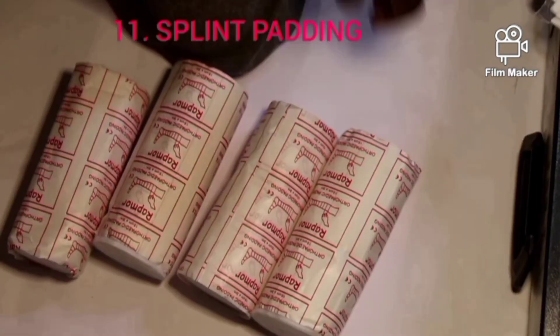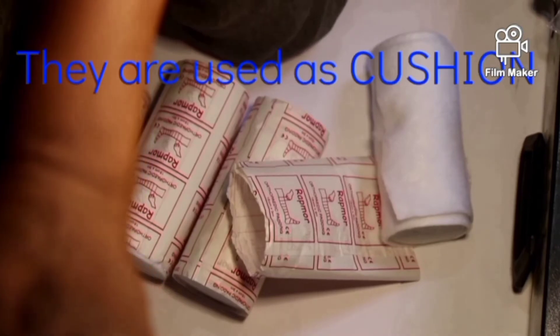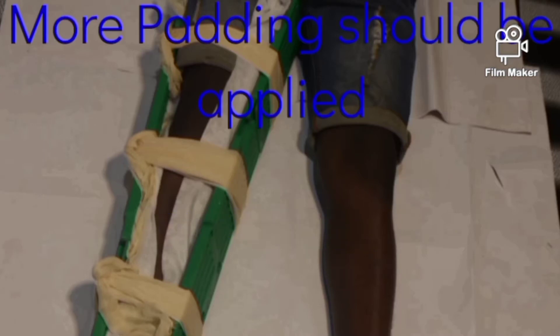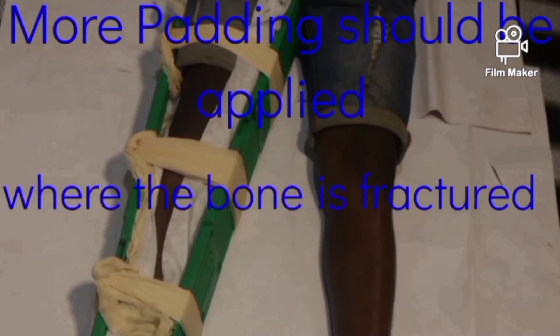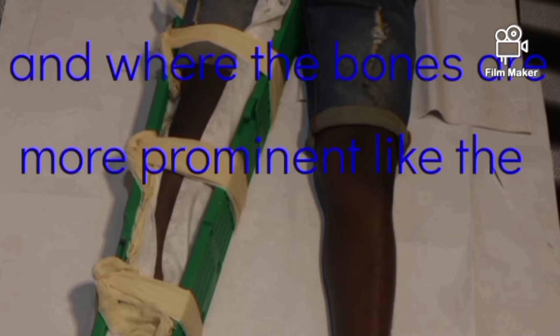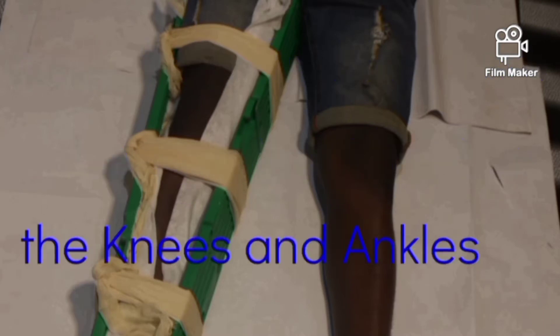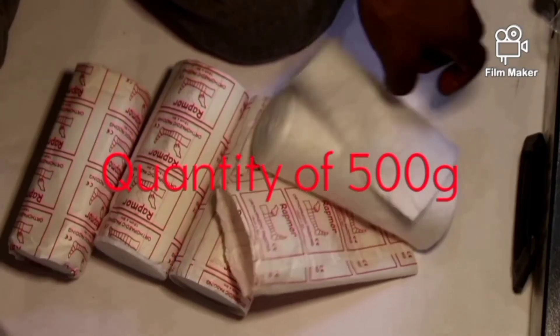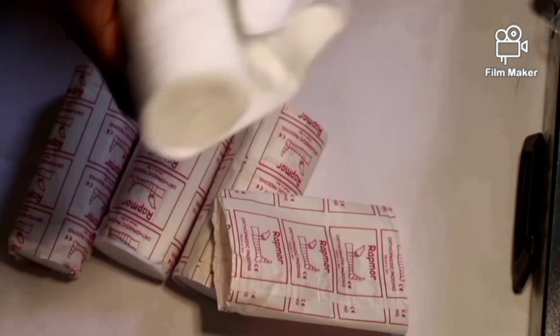These are splint paddings. They are used as cushioning when splints are applied in case of fracture. More padding should be applied where the bone is fractured and where the bones are more prominent, like the knees and ankles, to reduce the pain of friction. They come in a quantity of 500.